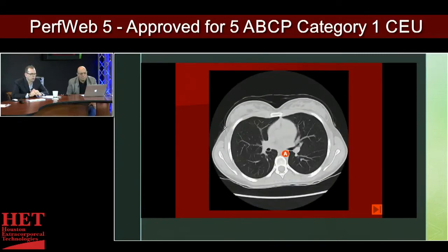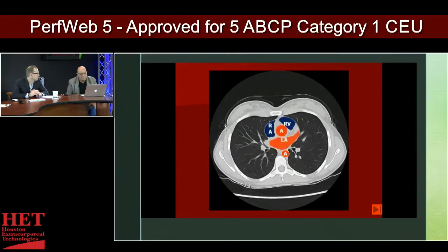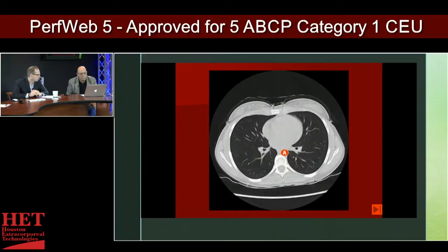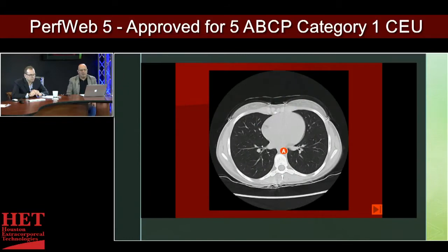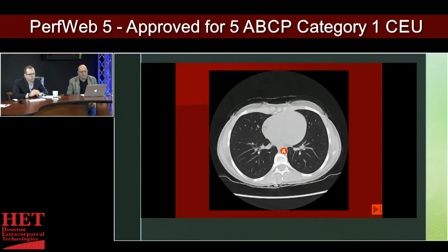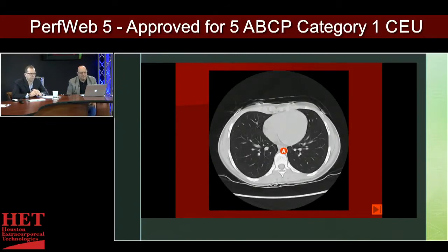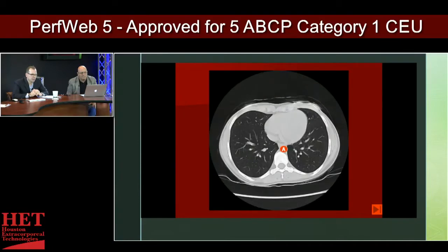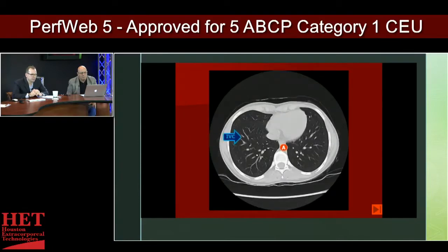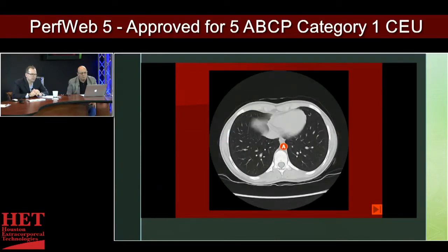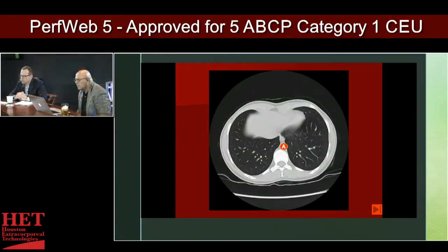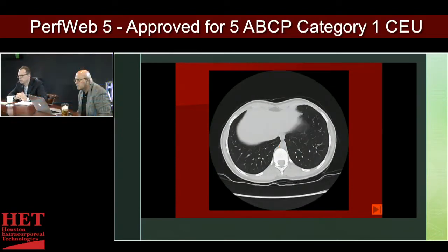This would be the window you'd look at for ARDS, pulmonary embolus, pneumothorax, or pleural effusions. This is non-contrasted because you can see that the blood vessels are not highlighted as much — it was more apparent on the last series than this one.